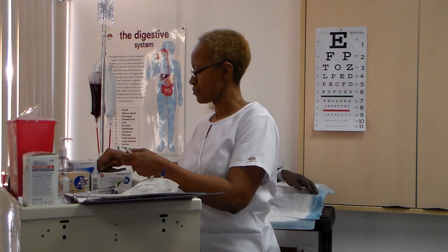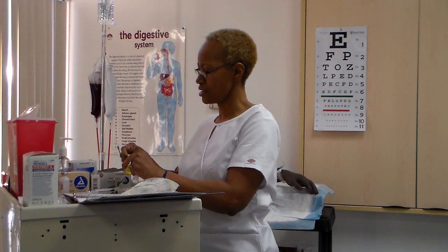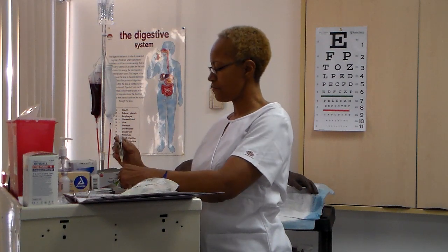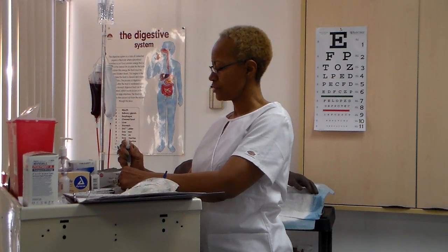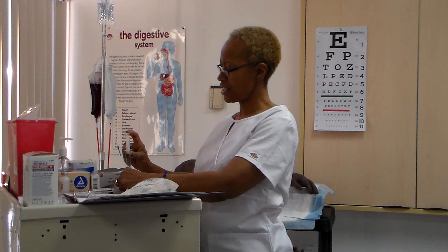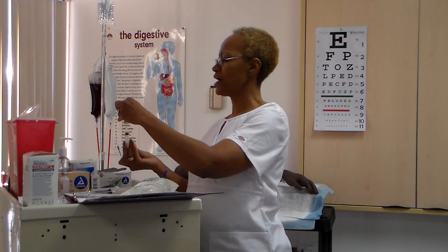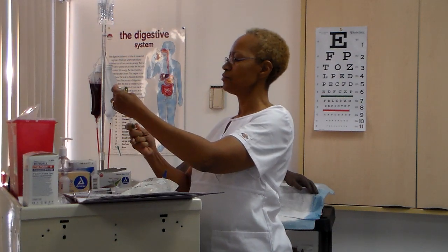Inject medication. So I need to draw up my meds just like you did last week, making sure that you clean your port, allow it to air dry. You've calculated how much medication you have to add into your new bag. Make sure your vial is down. Put the air in the center of the vial. Make sure that your needle does not touch the medication. Flip your vial up.